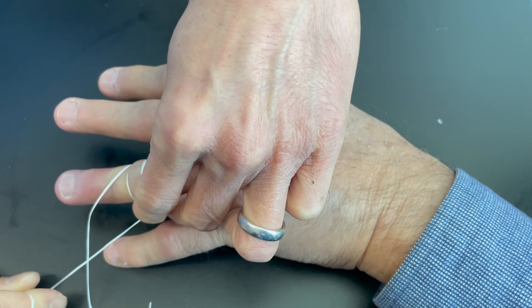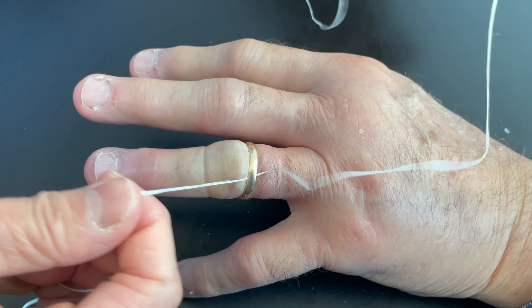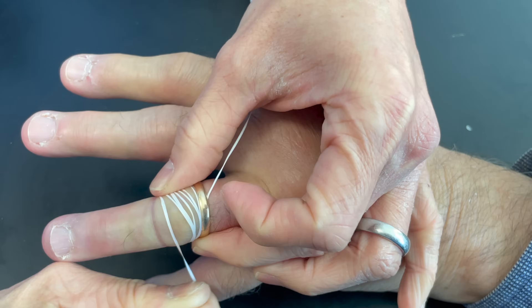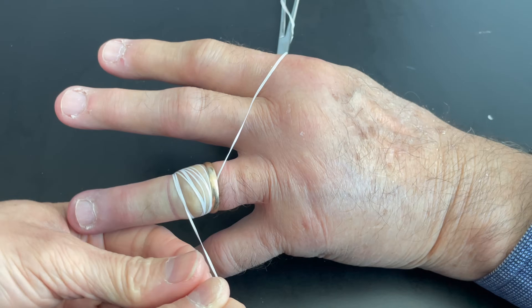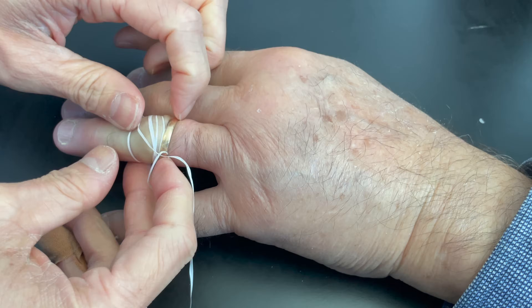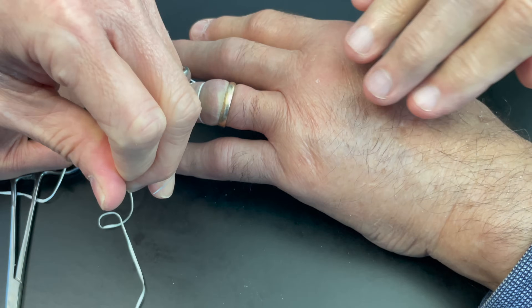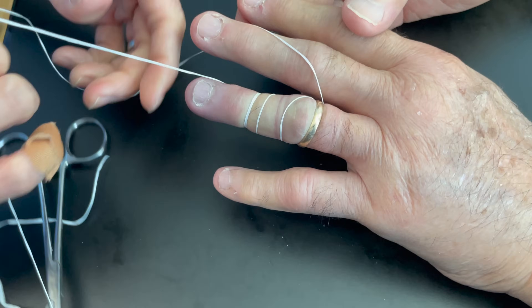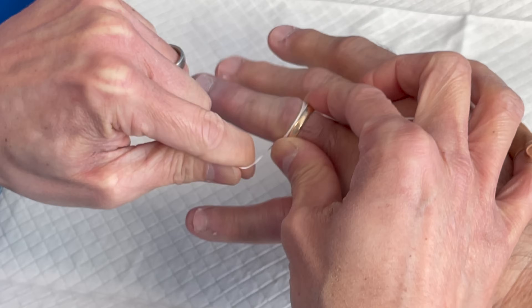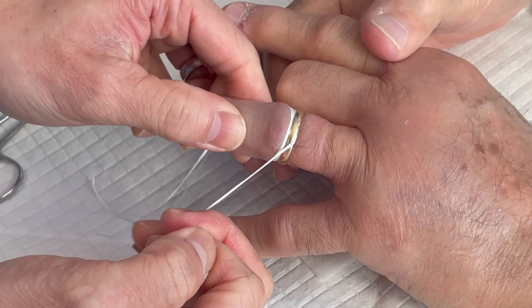Sometimes when the finger is really swollen you can't get that guard underneath the ring. A third problem is that if you have a patient with a ring with diamonds encrusted all the way around and you try to use ring cutters, you're going to lose or potentially damage some of those stones. Additionally, nowadays people are using harder metals for rings — they're no longer gold — and sometimes ring cutters will take a very long time to cut through the harder material.